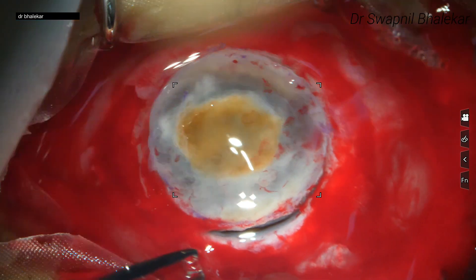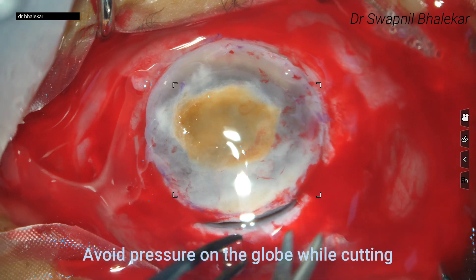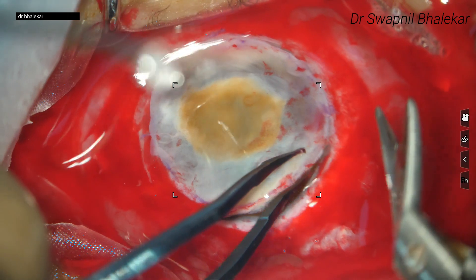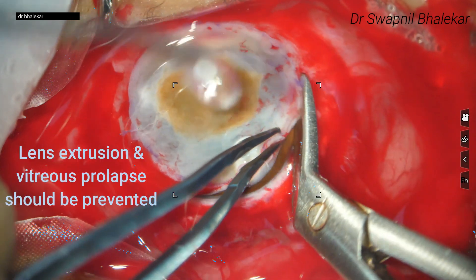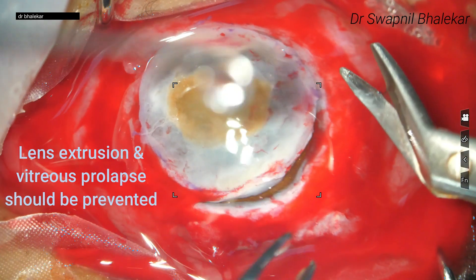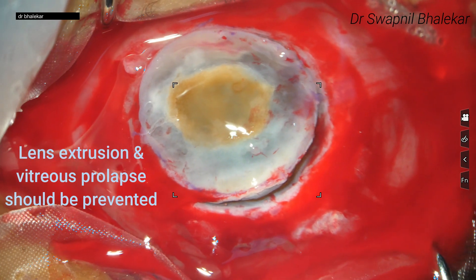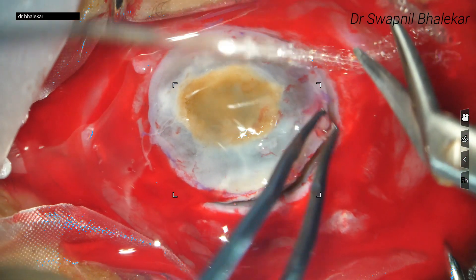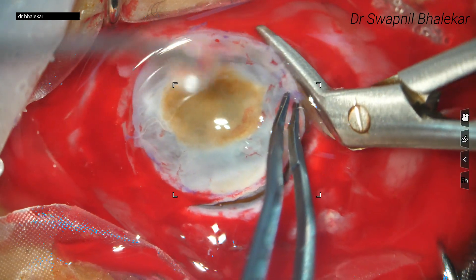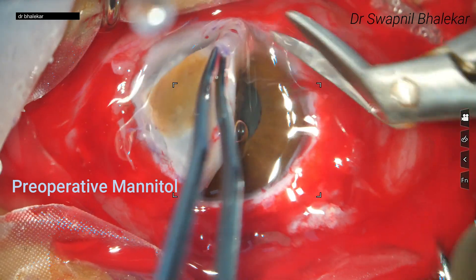This needs to be done carefully without applying any pressure on the globe. At this point, it is very crucial to avoid putting any pressure on the globe as it could lead to crystalline lens extrusion with or without vitreous prolapse. Keeping the lens intact is highly important during therapeutic penetrating keratoplasty. If the lens comes out with vitreous prolapse, it can allow infection to spread posteriorly, which worsens the prognosis. Giving preoperative mannitol also helps in preventing this situation.